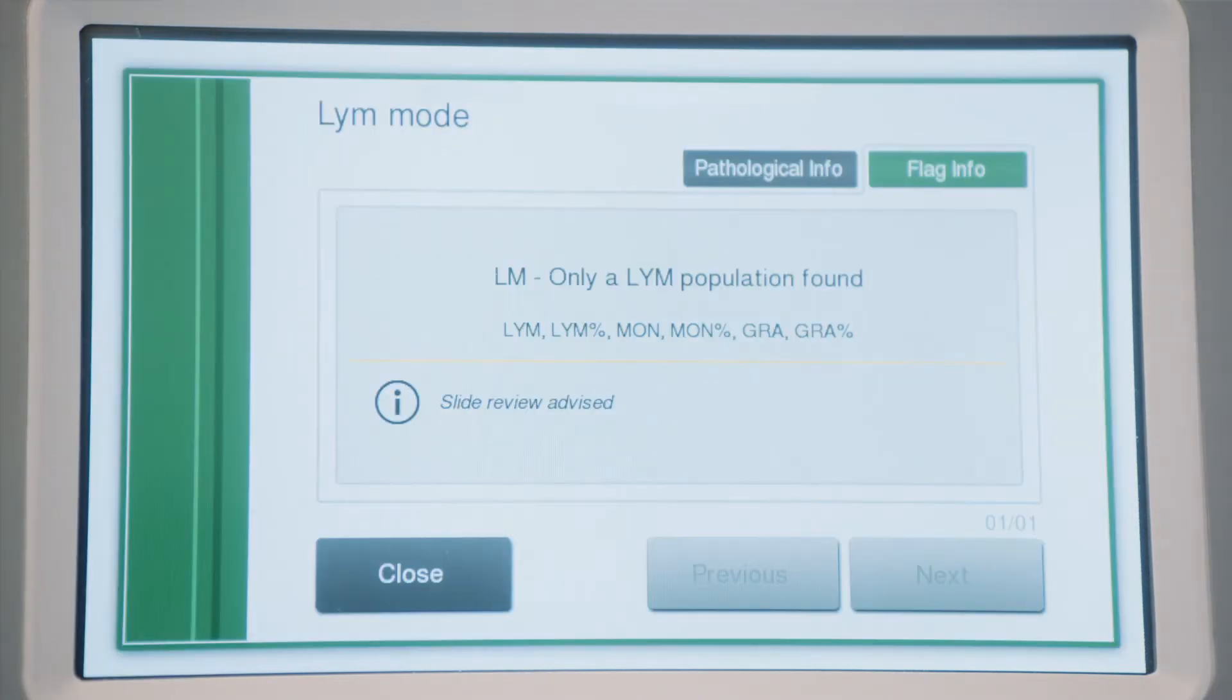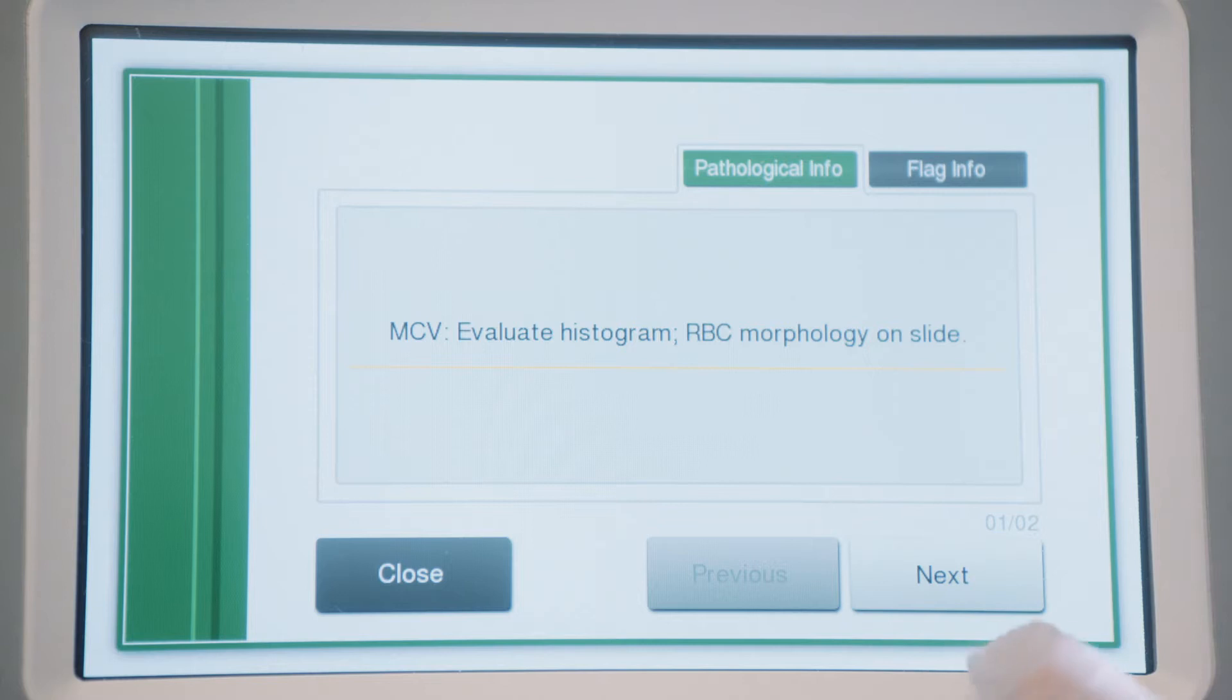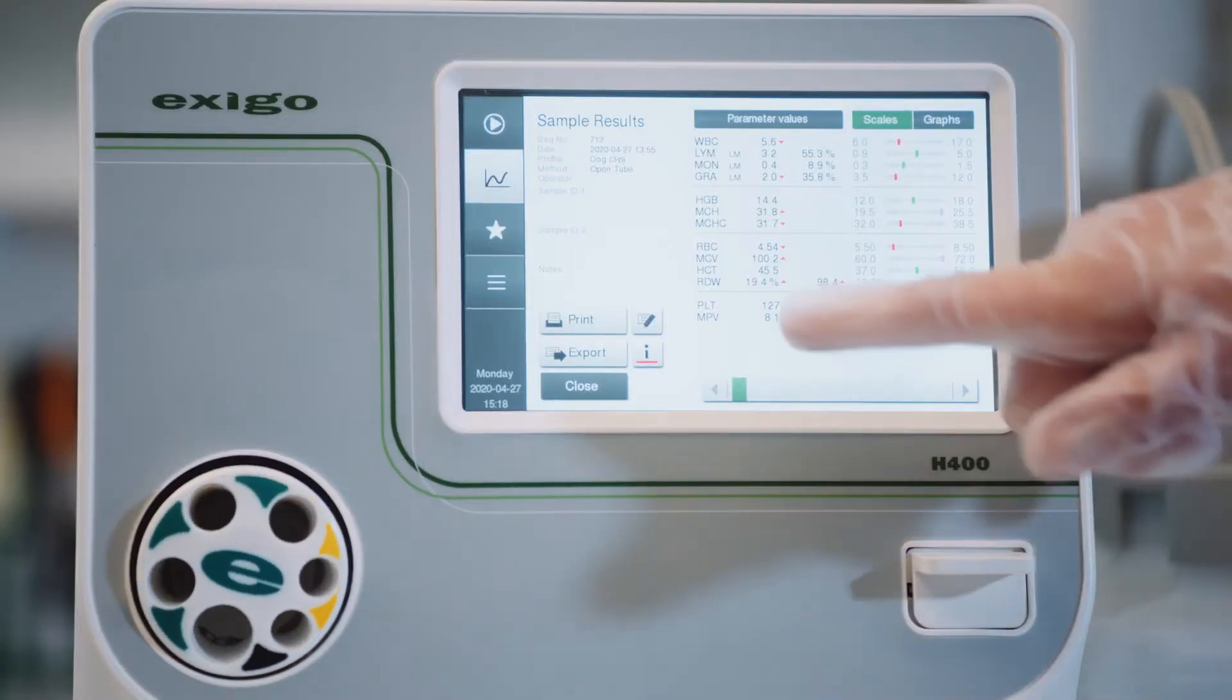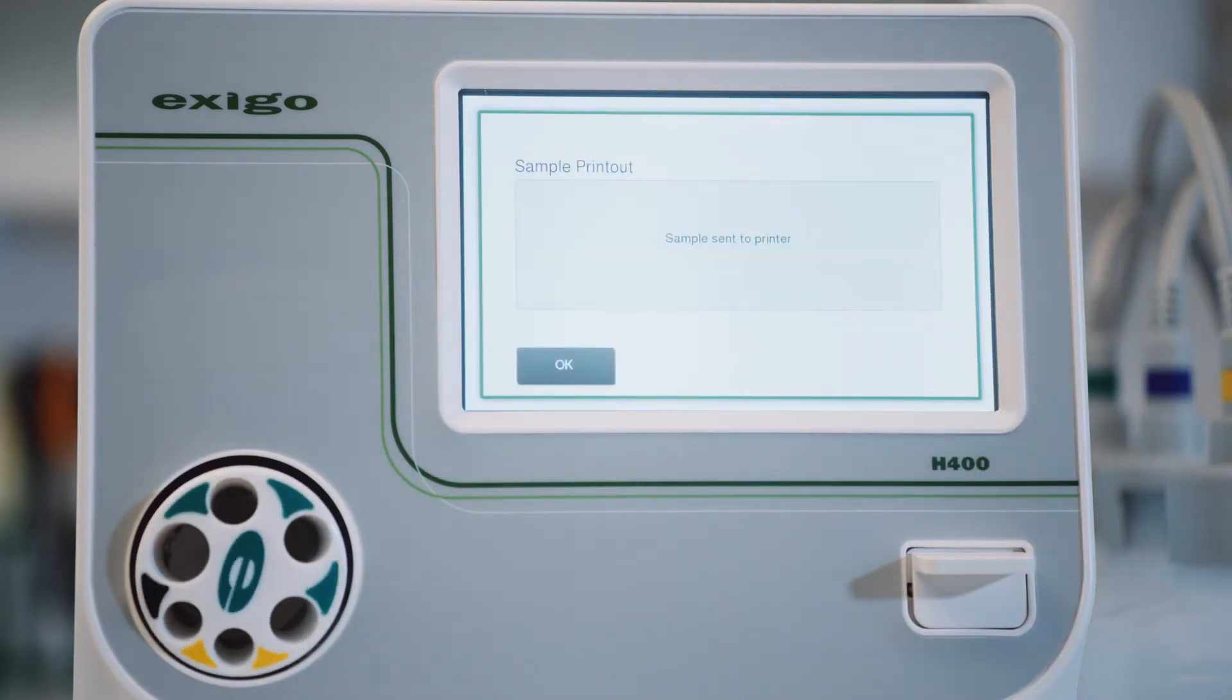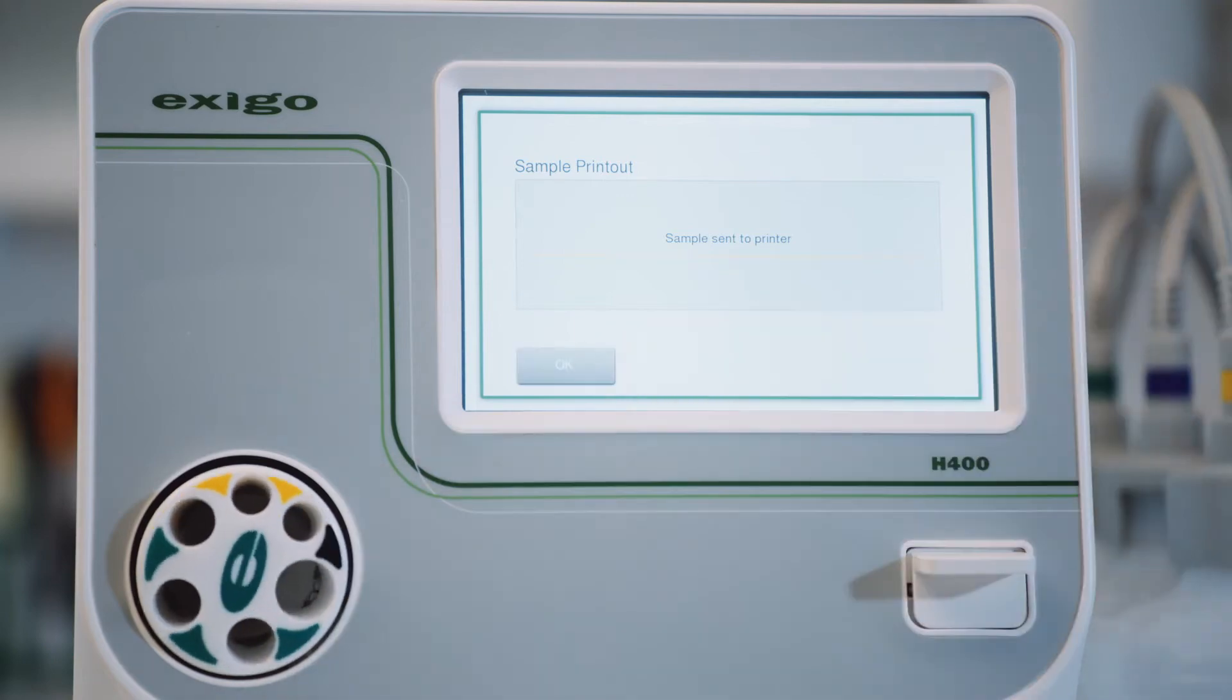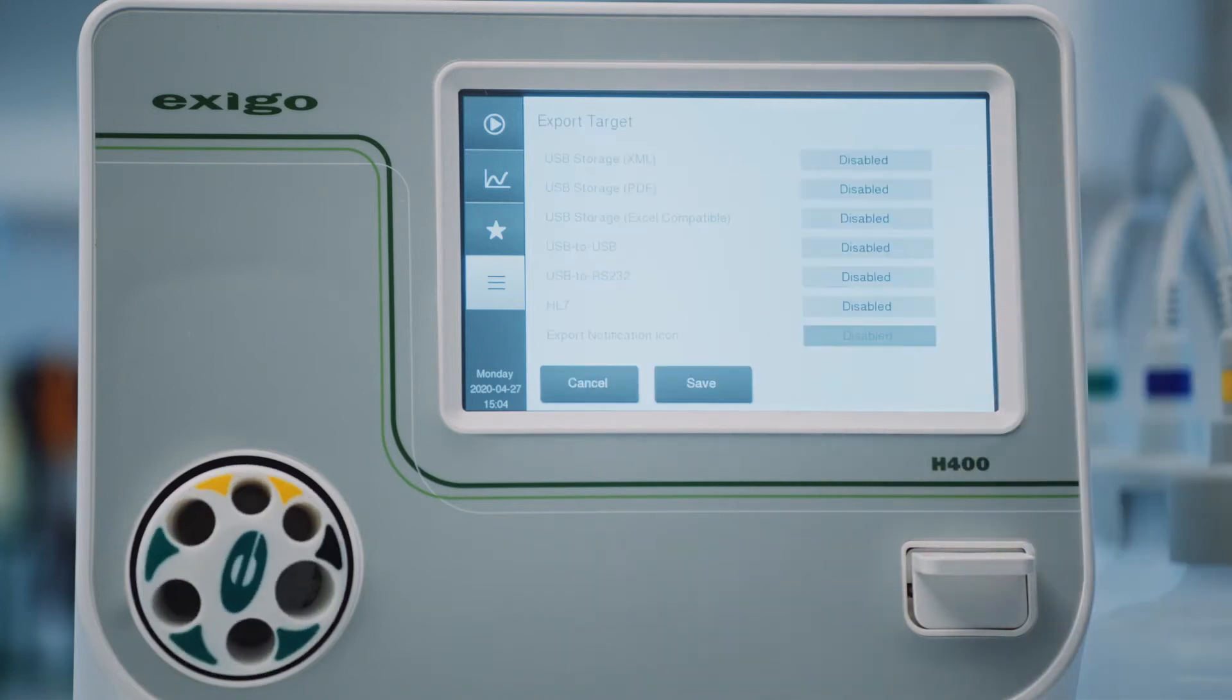Exego H400 also helps the veterinarian through pathological information flagging. Printouts are fully customizable as well, and cover any or all of the parameters, flags, and notes you choose to display. Better connectivity and improved communication protocols are also key features of Exego H400.